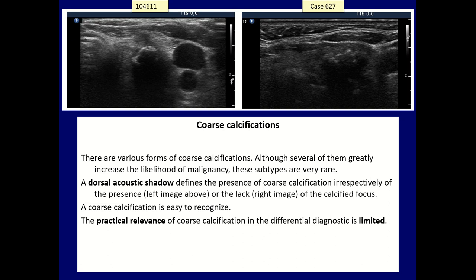The hallmark of coarse calcification is not the primary focus of the calcification, but the dorsal acoustic shadow it causes. It defines the presence of coarse calcification irrespectively of the presence or the lack of the calcified focus.